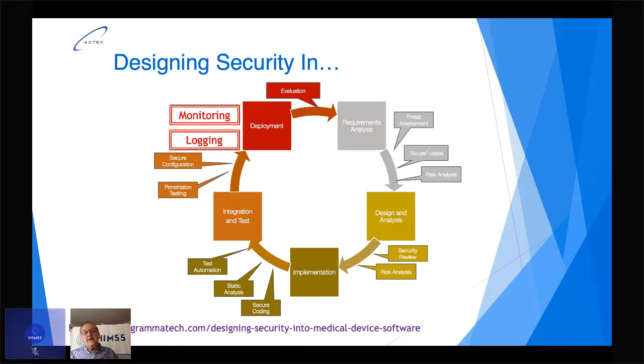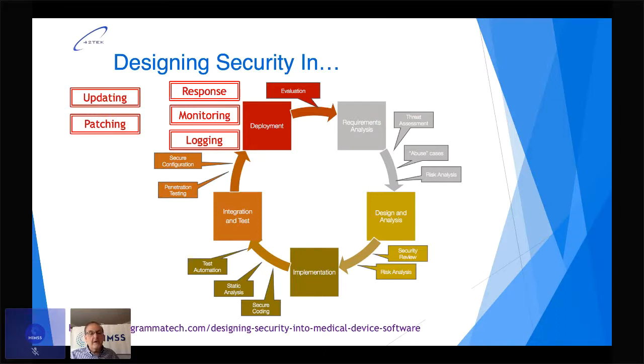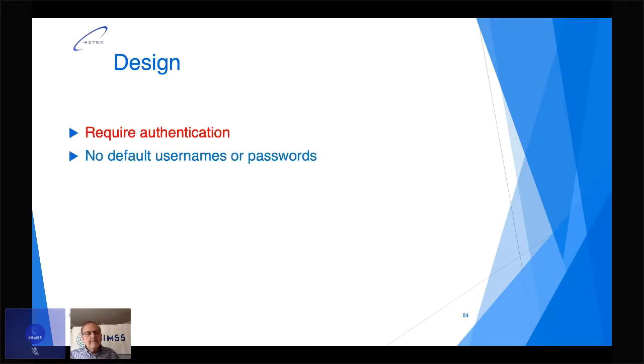And I am especially fond of pointing out that you need to do monitoring and logging so that you can detect incidents and respond to them. And of course, keep everything updated and patched. In the design stage, you want to make sure that access to the device is properly authenticated with a username and password, and possibly multi-factor authentication at some stages. That devices don't get sent out with a default username and password that can be left, but that when you set something up, it has to have a unique and secure username and password set up. It's good that these devices not stay on the network when they're not needed. Transmissions should be encrypted.